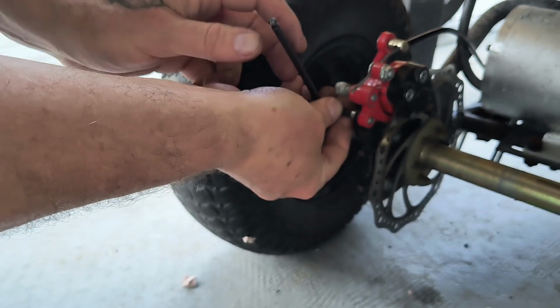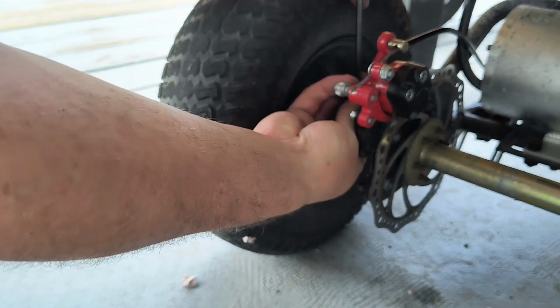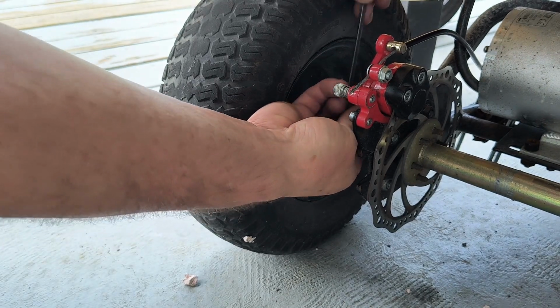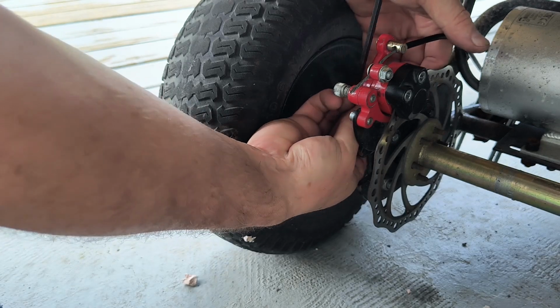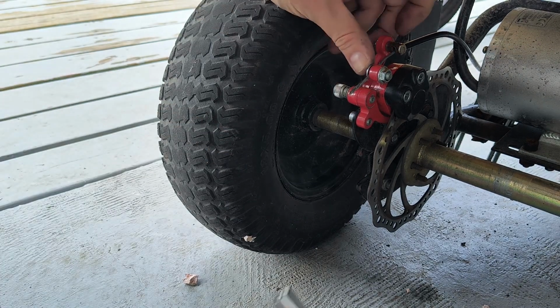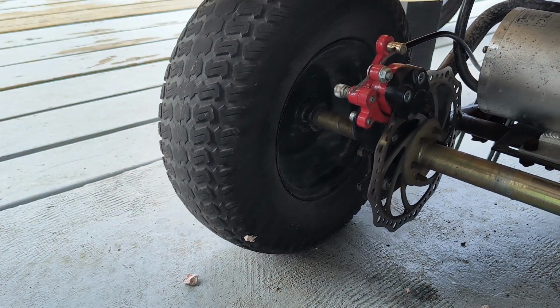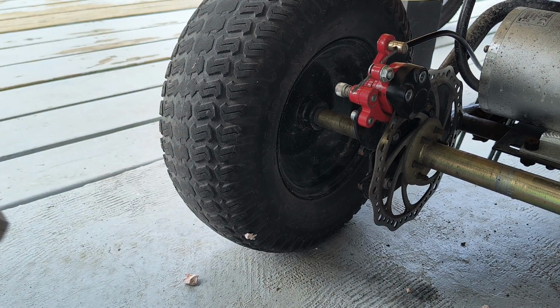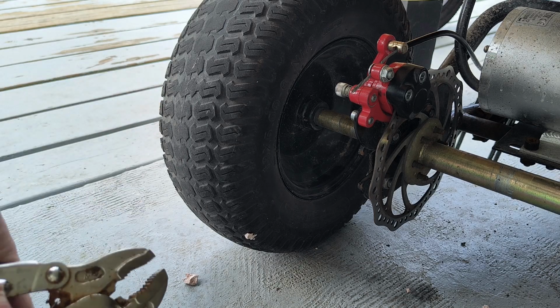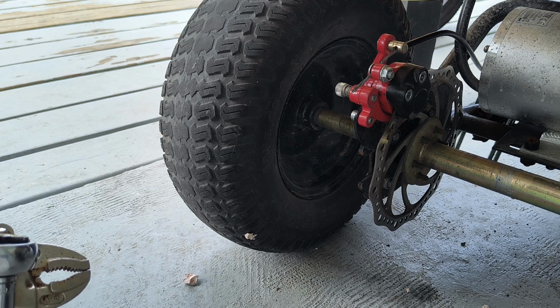Let's make sure everything's tight. So it's got good brake pads, it's got good brakes, good return spring. It's better set up. Like I said before in a different video, the downside of custom means constant upkeep. Okay, so we now have reliable disc brakes back of my bike / mobility scooter. Still can't believe this qualifies for it, but yeah, it's a mobility scooter. Talk later.